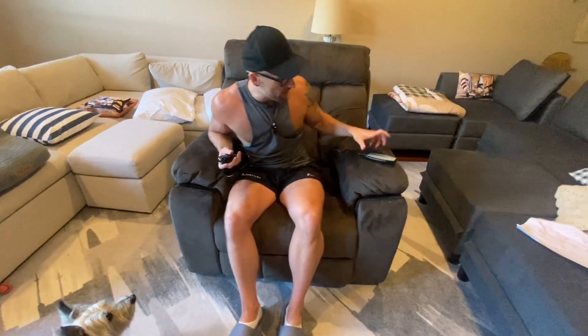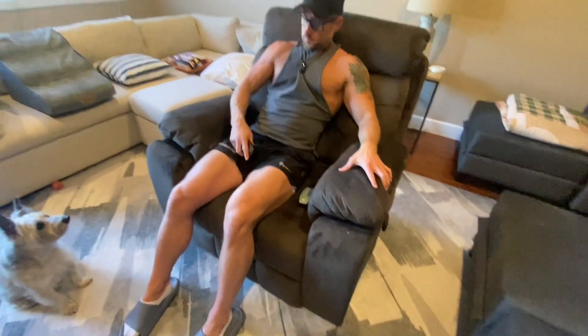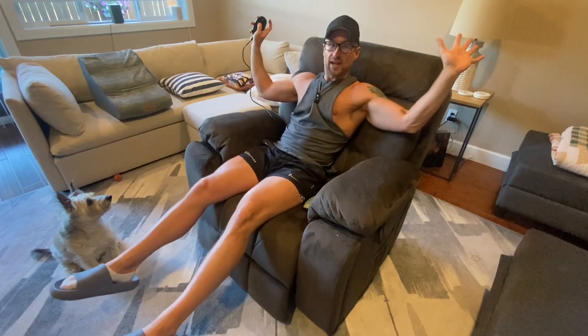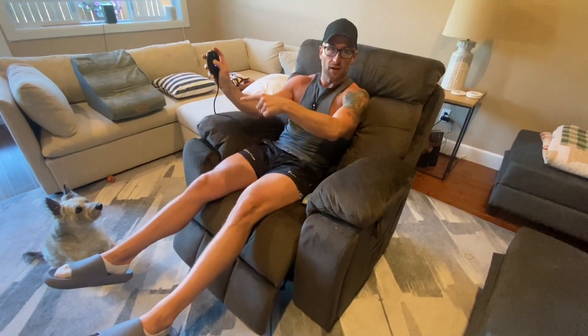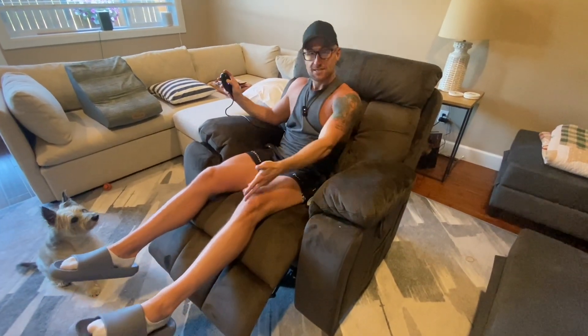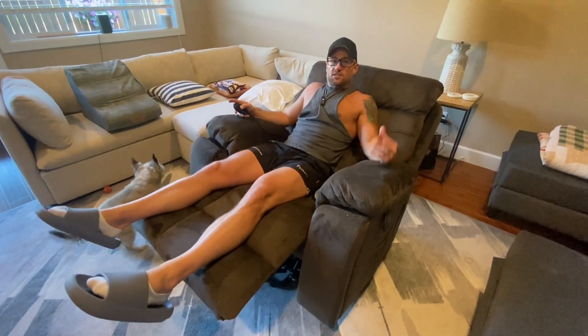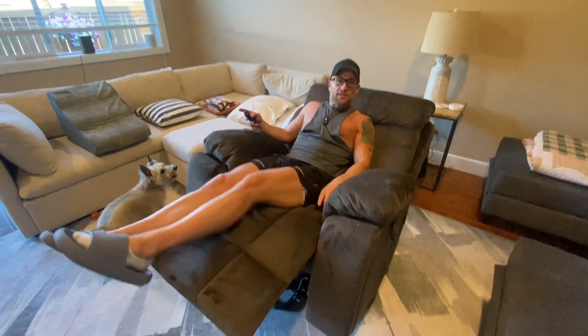The other thing about it that's extremely important — we have the recline feature, hands-free. Well, you use your finger, but that's it. Look at this. Picture yourself in this; I feel like once you get in this you're probably never going to leave it.